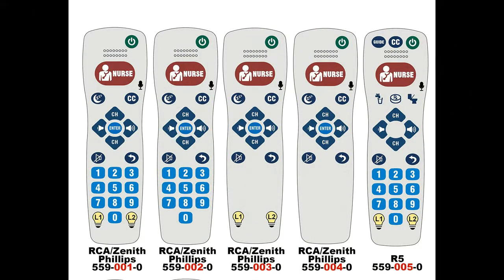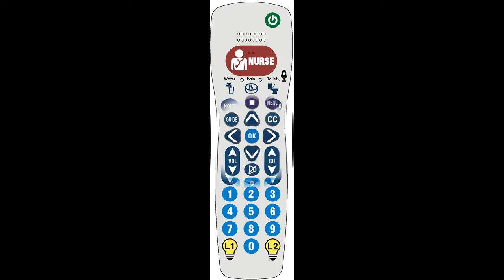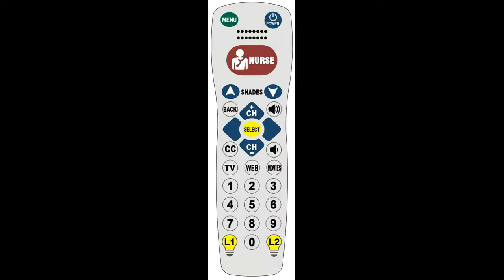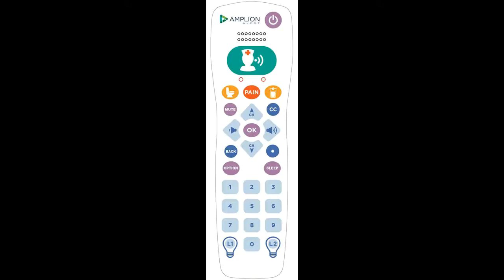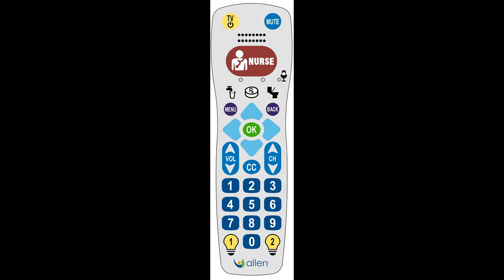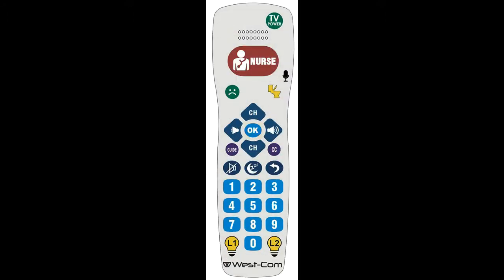Anacom Medtech's Series 8 pillow speaker is available in a variety of standard keypad options. Specialty functions? Not a problem. We can design and customize a keypad to meet your requirements. If your facility currently utilizes an interactive system with your nurse call and TVs, please let us know. We offer OEM keypads for most interactive systems.